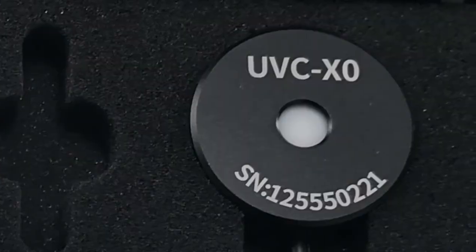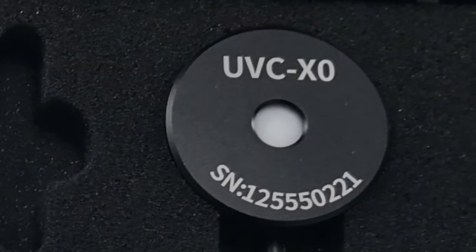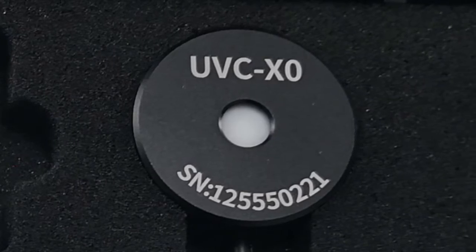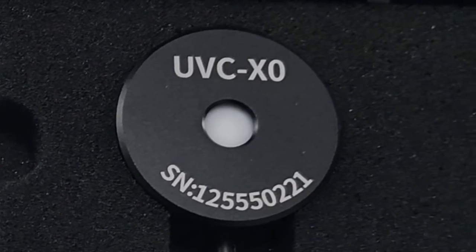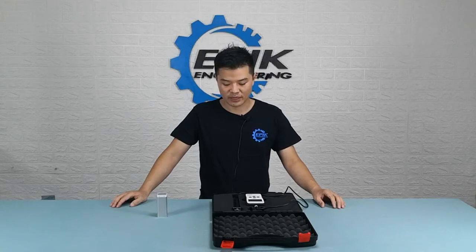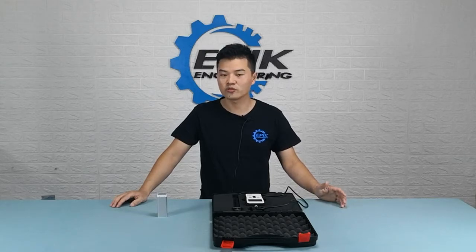A probe is basically a sensor, and on top of the sensor there is a filter that allows a very specific wavelength to go through and reaches the sensor underneath. In this case we're using the 254 nanometer wavelength filter, meaning it only allows the 254 nanometer wavelength to go through.